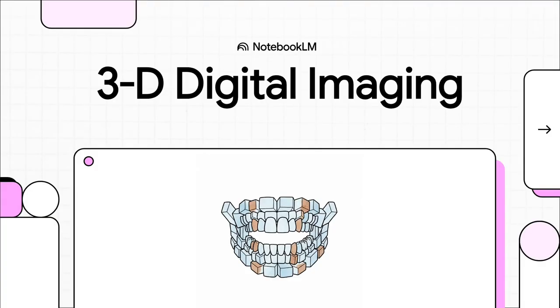You know when you're at the dentist and they take that x-ray? For like ever, it's just been a flat 2D picture. But what if they could see everything? That's exactly what 3D dental imaging is all about. It's this amazing technology that gives dentists a full three-dimensional look inside our mouths.